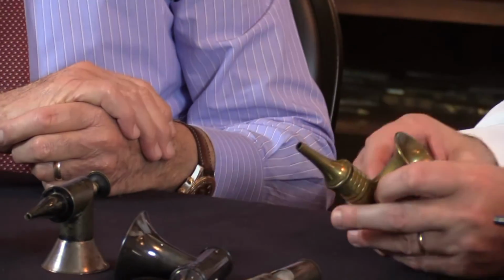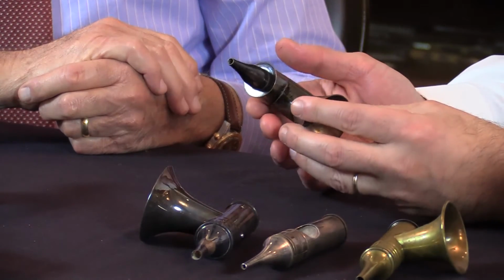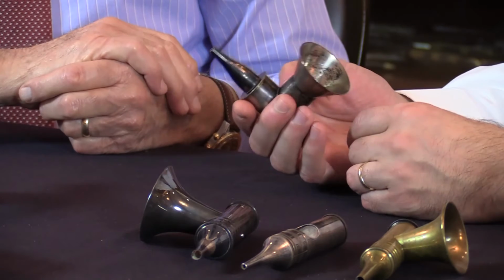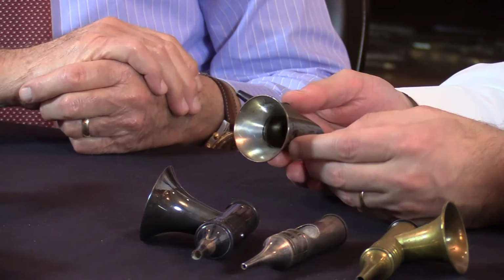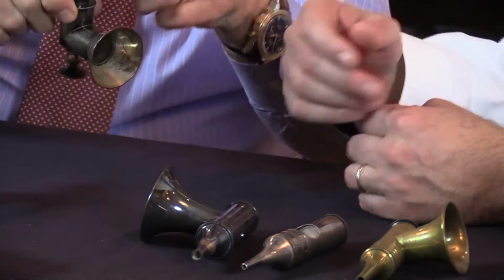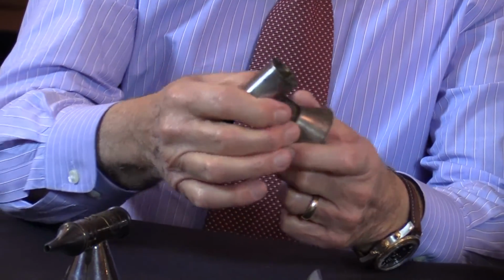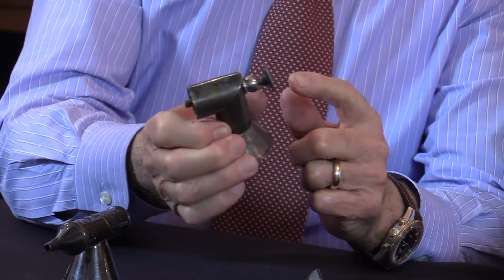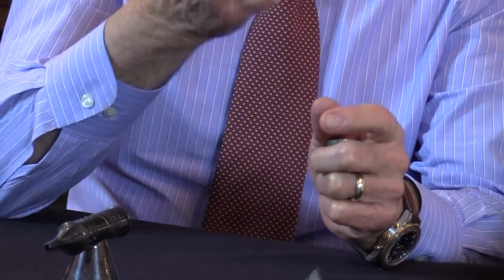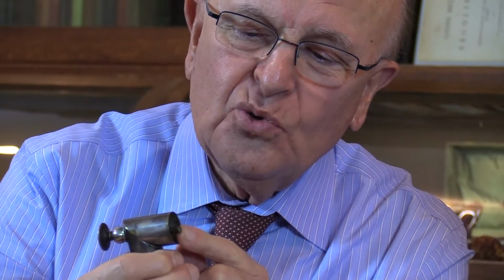Similarly, this is another Brunton's scope. And then this one, Clark's, is a similar speculum with mirror made in America at the time. I think that's the first American manufactured. And this one here, he applied a magnifying lens, and instead of being at the eye end, there is a tube, and the lens is right at the tip of the tube. That's the only otoscope I have seen that has this kind of setup.